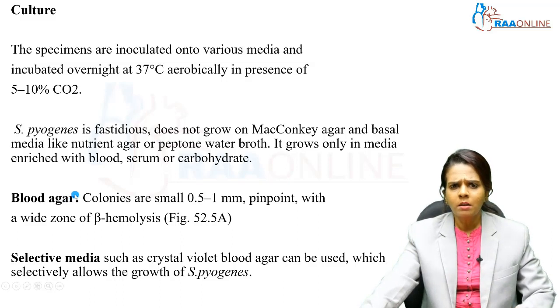Okay. So in blood agar the colonies are pinpoint. So this is the key identification. Pinpoint colonies, that is of size 0.5 to 1 millimeter.